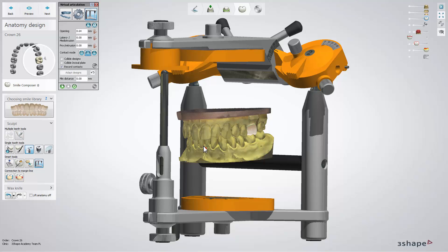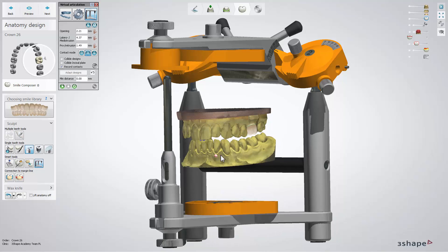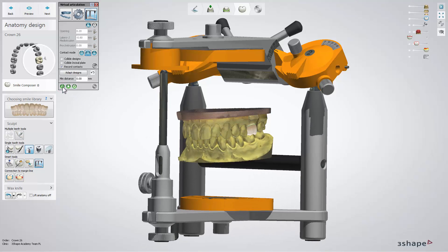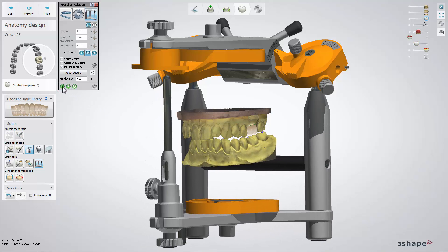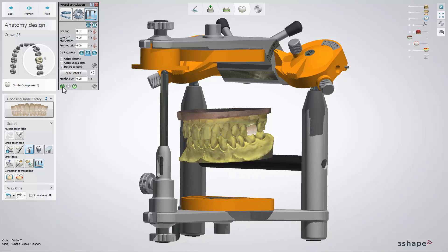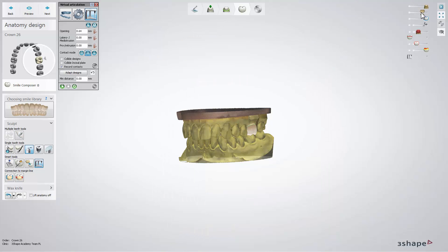Jaw movements can be done automatically or manually. After choosing the type of movements you would like to perform, use the Plane button to reproduce jaw movements in the articulator and see all movements, obstacles, and contact points with depth.